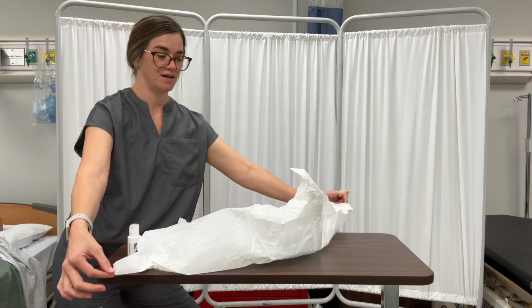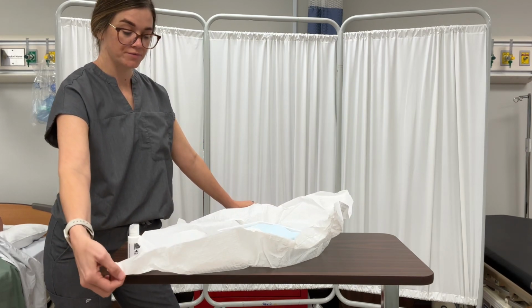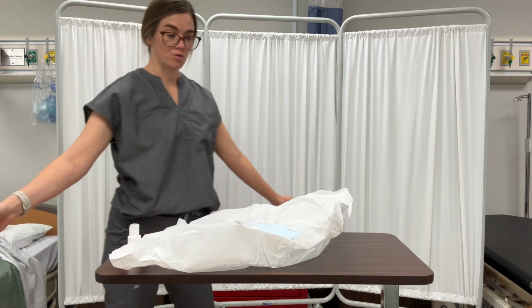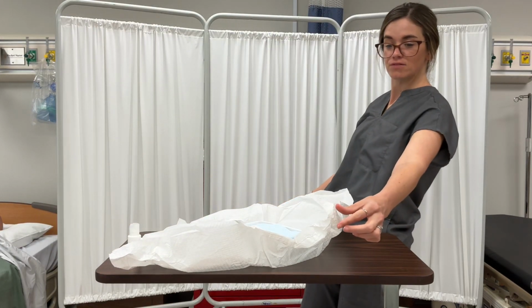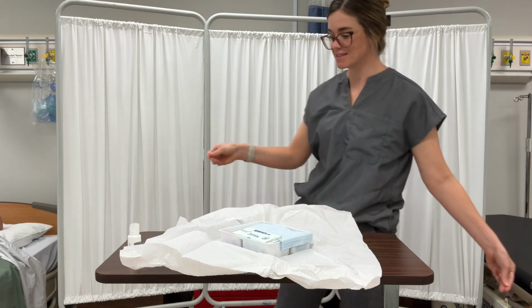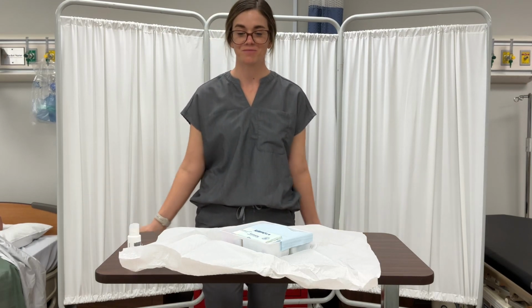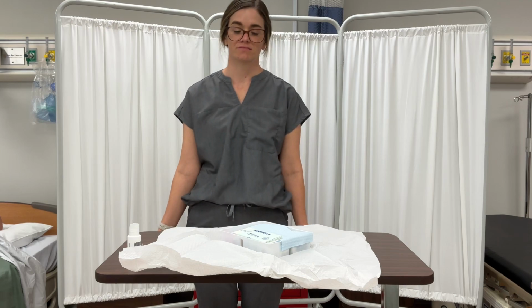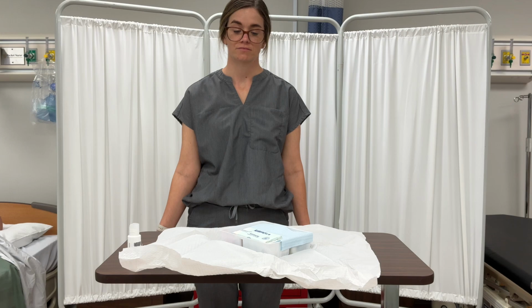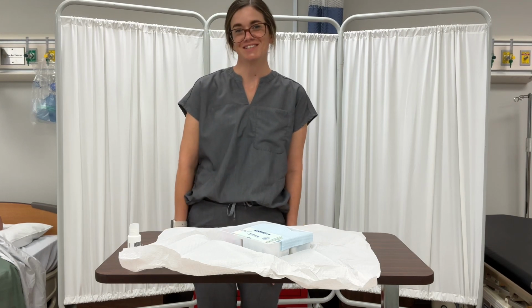Ooh, okay, now that may happen to you. What you can do, this is reality, y'all, this is what's going to happen. You can walk over here very carefully, pull it down, because remember, we have that nice little 1-inch border that we can mess with as much as we want. There we go. Okay, and so she's just going to repeat that process until all the items are exposed in the field as needed. Okay, let us know if you have any questions.